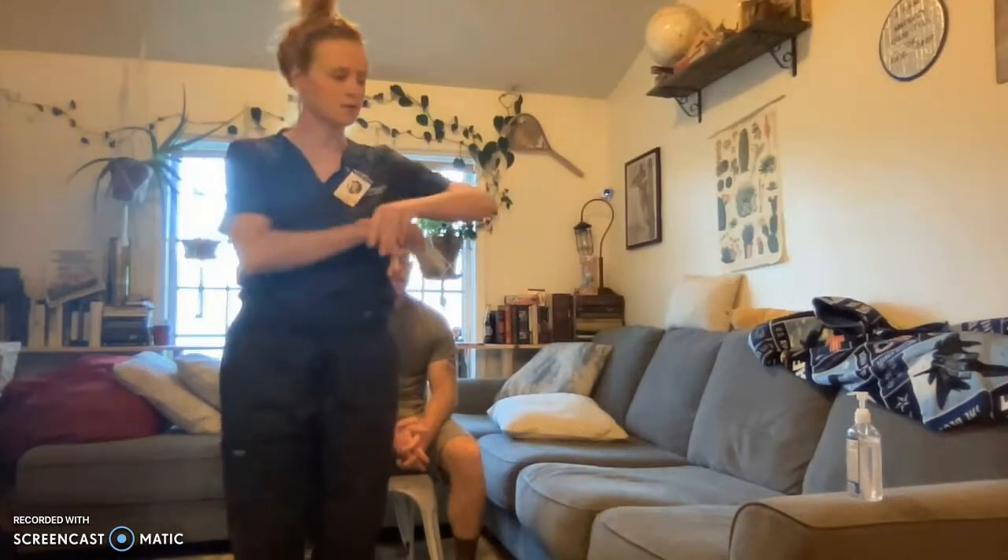Hi, my name is Emily. I'm going to be performing this skill: ambulating with a gait belt. My supply is the gait belt.